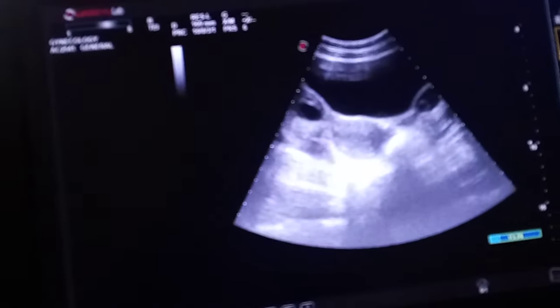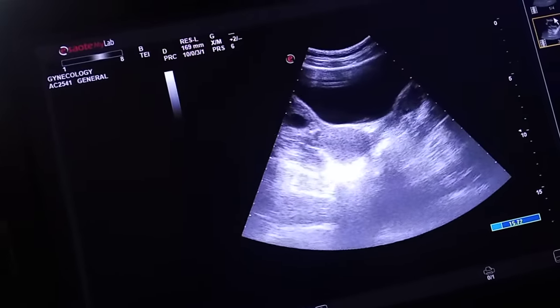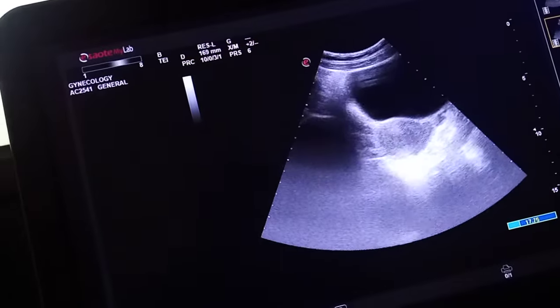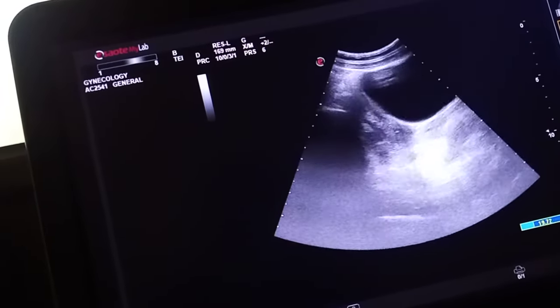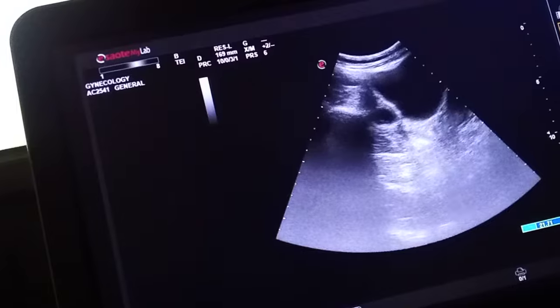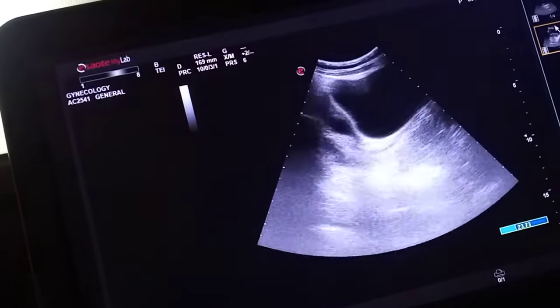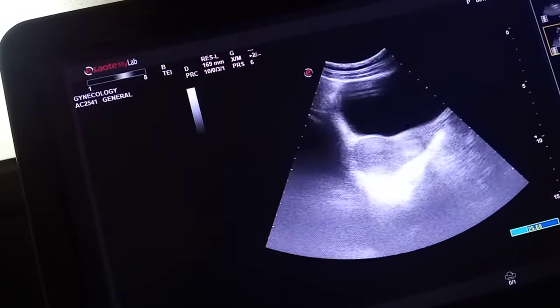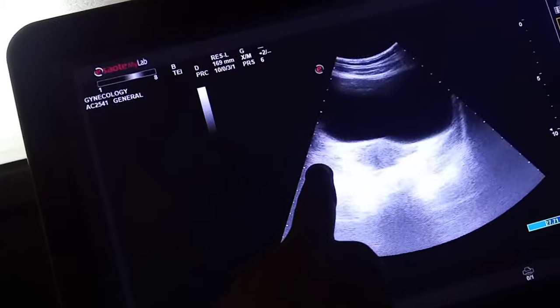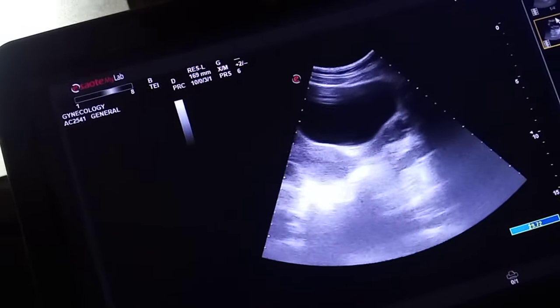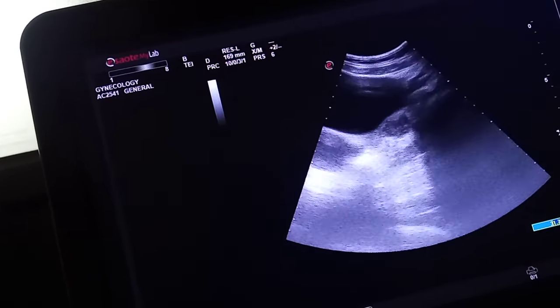This patient, 20 years of age, presented to me with lower abdominal pain. Ultrasound shows a normal anteverted uterus and normal bilateral adnexa. As you can see, this is a follicle in the right ovary which measures 18 mm in size.